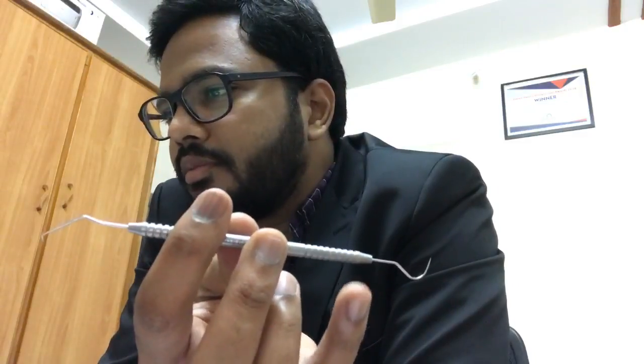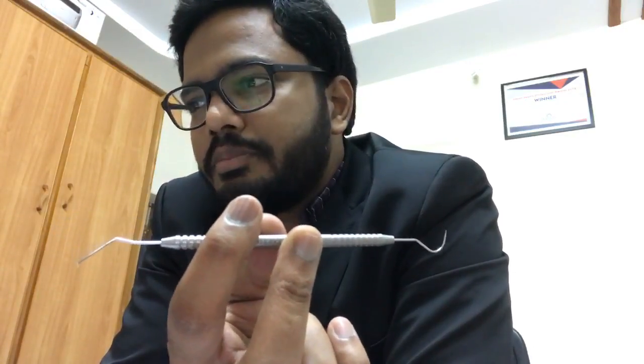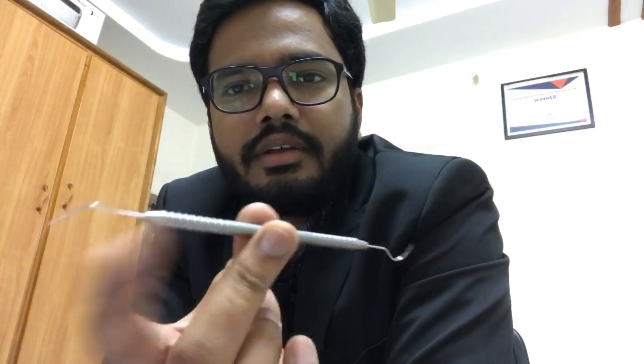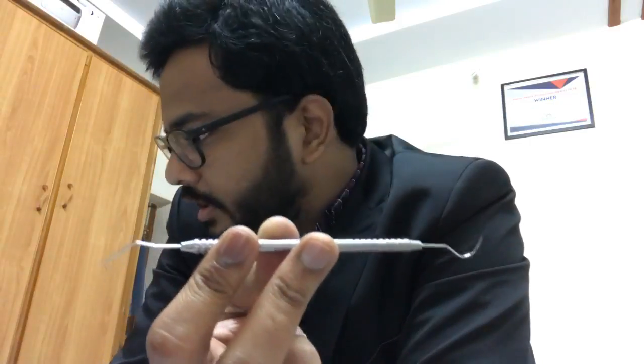So this is an explorer or curved probe, right? As Abhishek rightly said, one side we call the shepherd's hook. The other side we call the interproximal explorer. The shepherd's hook is for the occlusal aspect, so it is mainly used for evaluating the consistency of the occlusal aspect. The pigtail part, or interproximal explorer, is used for evaluating the consistency of the proximal surfaces, right? It's a double-ended instrument, as you all know.